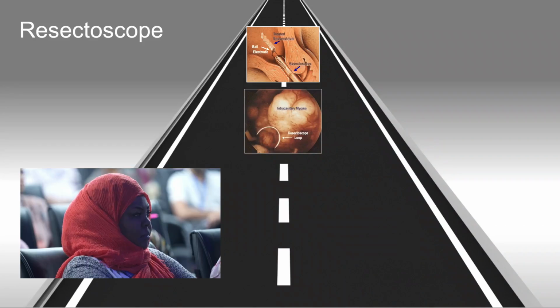Now the last one is the resectoscope. This is the resectoscope. I will discuss the resectoscope in the later part of the lecture. I will demonstrate how to assemble the resectoscope and how to do operative work with the resectoscope. So this is the different channel, the resectoscope.